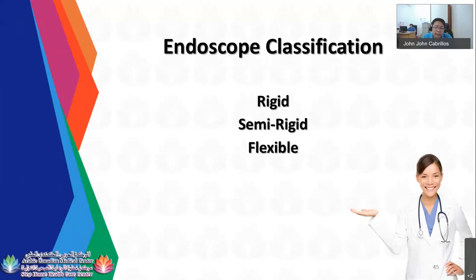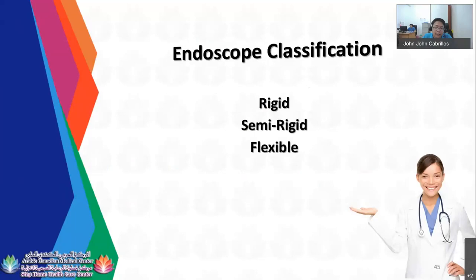So this endoscope has an LED, or light emitting diode. They have light that is the main source or supply of light once the endoscope is inside the body of the patient. Let's be reminded, if the light fiber shows a dark area, it means that the LED is damaged. There is no good visual image if your LED is damaged.